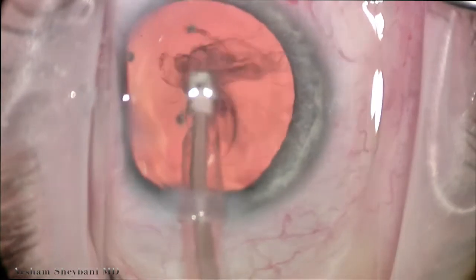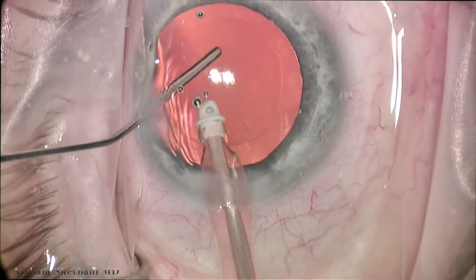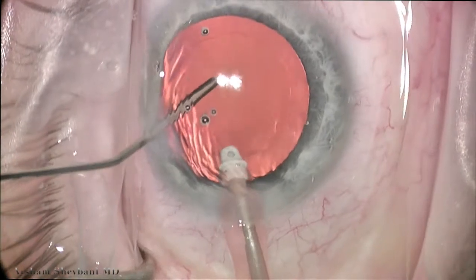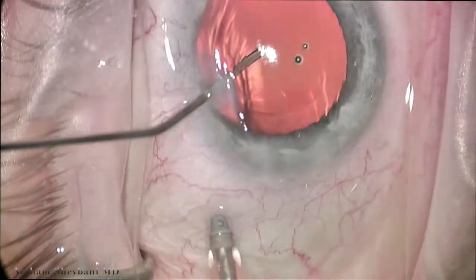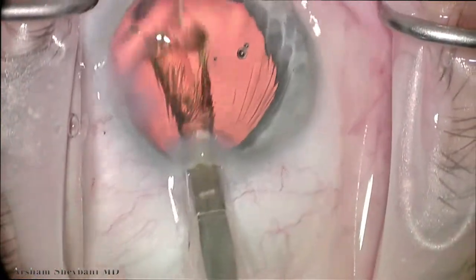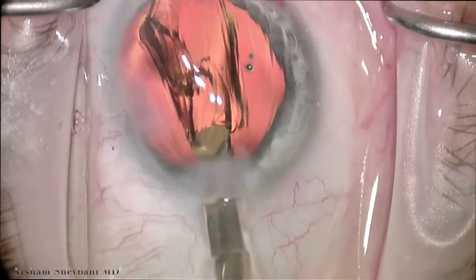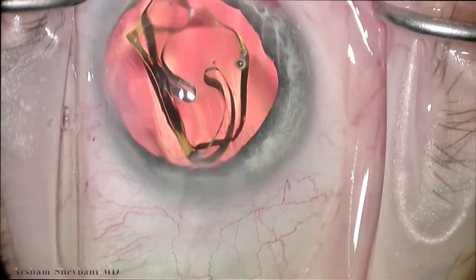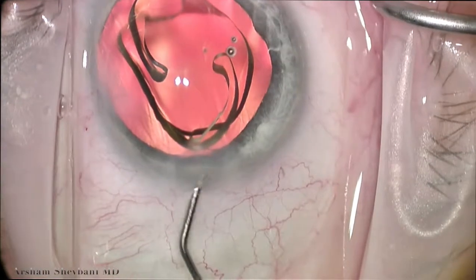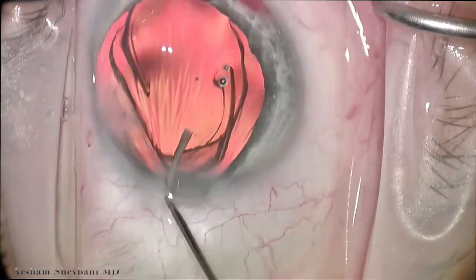After we remove the epinucleus and cortex, we then maintain the chamber by injecting the viscoelastic with the irrigation off. This way, it doesn't shallow as much and cause reflux into the anterior chamber where sometimes you can lose the view. We then place a folded acrylic intraocular lens into the capsular bag, positioning it with just a 27-gauge blunt cannula.